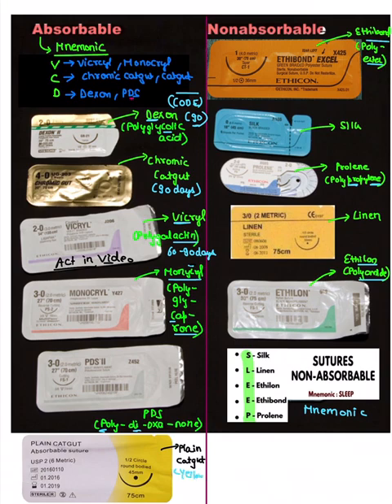We will be summarizing the entire color code, don't worry guys. And this chromic catgut, do you see it looks brown in color? Hence chromic catgut. You can also remember this when we read about chromoblastomycosis. We have brown colored bodies in chromoblastomycosis, known as sclerotic bodies, medlar bodies, muriform bodies, because they were verrucous wart-like bodies, brown in color. So here also chrome gives a brownish color.